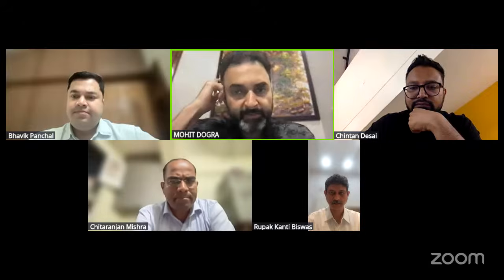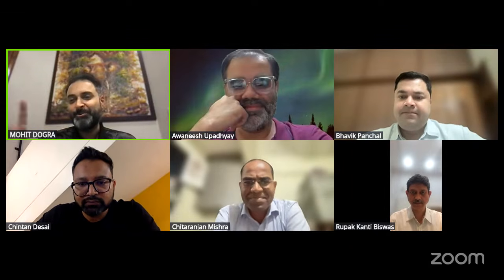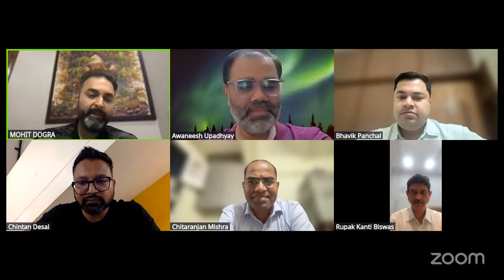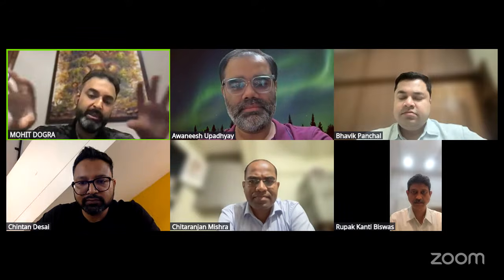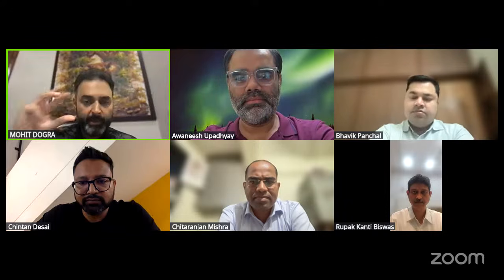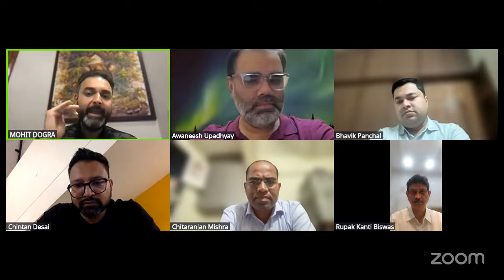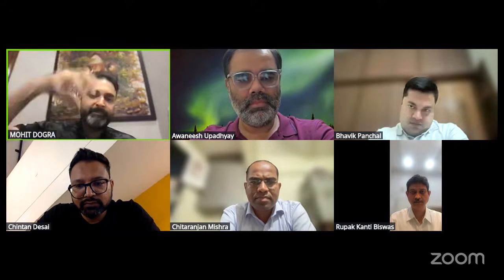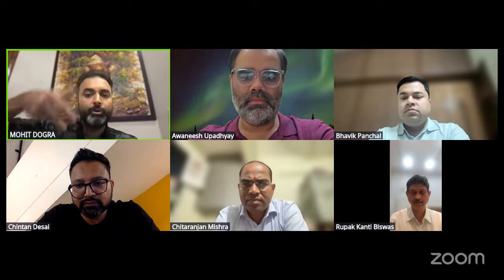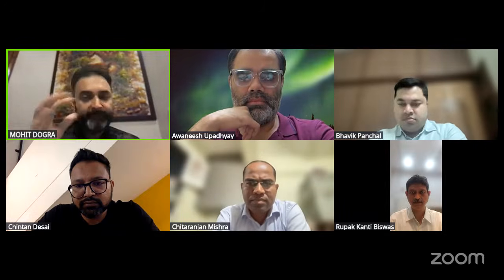Yeah, thanks, Bhavik, and great study, Dr. Chintan. I have two critiques of this, which I'll come to at the back end of my comment. But I have to say that one has to differentiate and dissociate these two things. If one wants to take advantage of a liquid, which in this case is PFCL and not viscoelastic, to help in fashioning your flaps also, then PFCL is the only choice. You can't put visco just after staining and then try and fashion flaps.